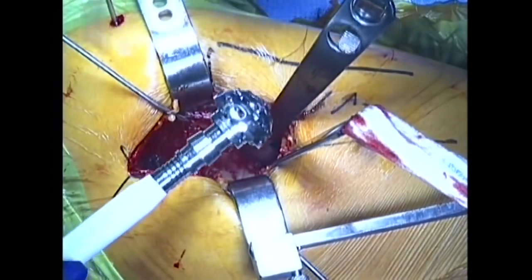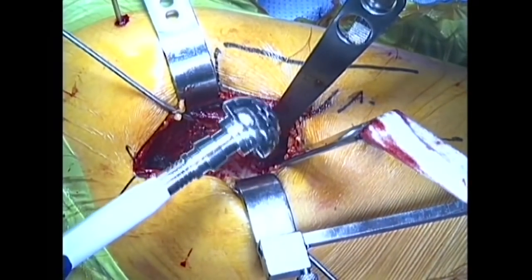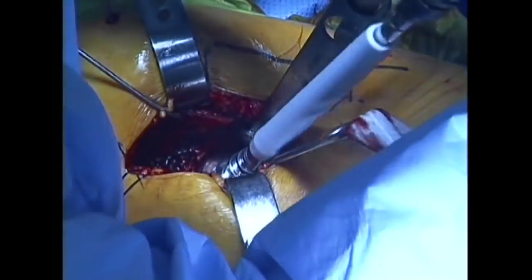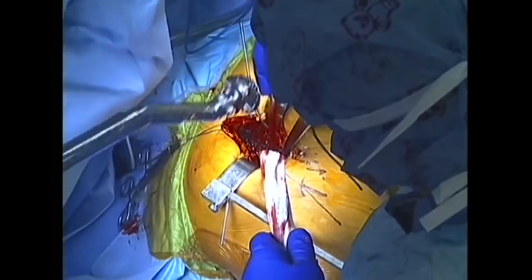The socket is fully exposed and ready to be reamed. Specially designed reamers are used to remove the painful arthritic surface of the socket, applied in progressively larger sizes until a tight fit is achieved within the socket.